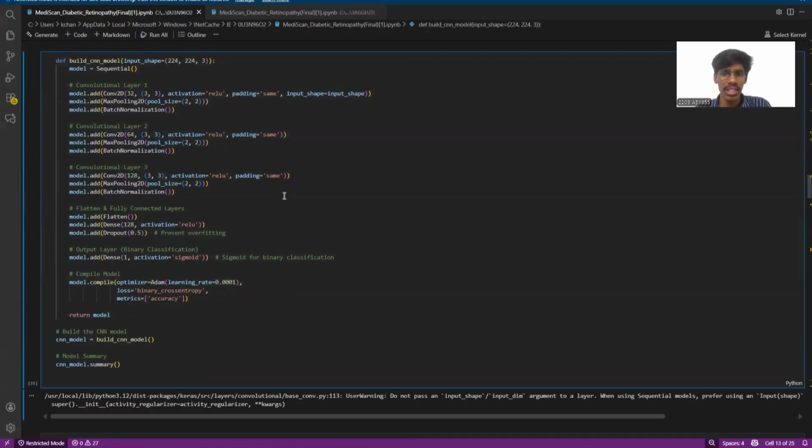In this cell, this function builds a three-layer CNN that extracts visual features using convolution layers and pooling, while using batch normalization to stabilize and speed up training. It includes a fully connected section with dropout, which helps to prevent the model from memorizing the data by randomly turning off neurons. The final layer uses sigmoid activation to output a single probability score, making it perfect for a binary classification task. Finally, it compiles the model with the Adam optimizer and binary cross entropy loss, setting it up for efficient and careful learning.